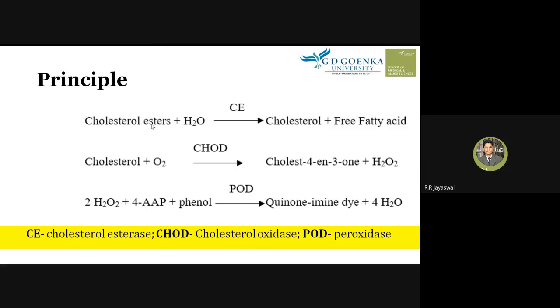Other components present in the serum will not participate in this enzymatic reaction, because serum contains a mixture of biomolecules. It contains triglycerides, fatty acid, cholesterol, glucose, protein, amino acid, vitamins, minerals. So many organic and inorganic compounds are present in the serum, and those compounds do not participate in this enzymatic reaction.